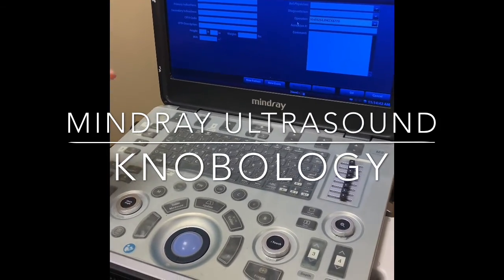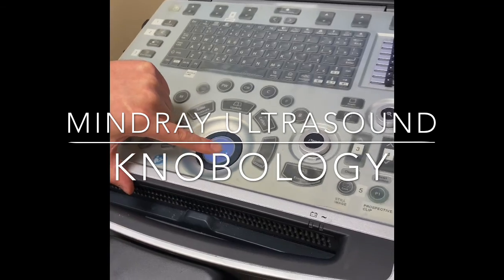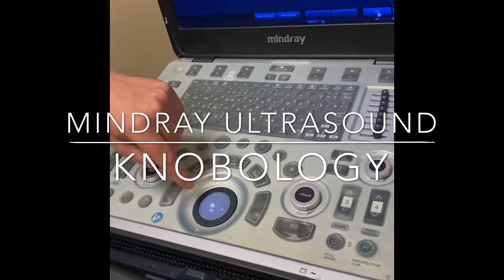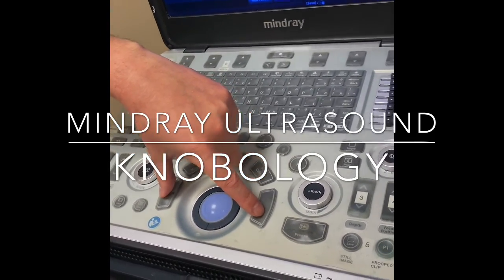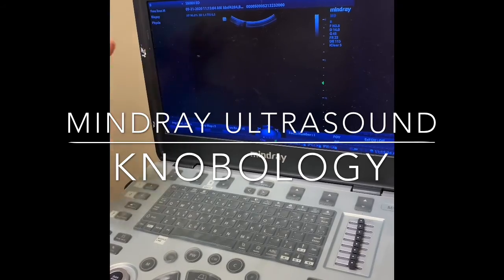This is important. Once you are satisfied with this page, you use the trackball to move the cursor over to the button that says OK. On either side of the trackball, there is a button. Either one of these buttons could be used to click. When you click the OK button, you go to the scanning page.